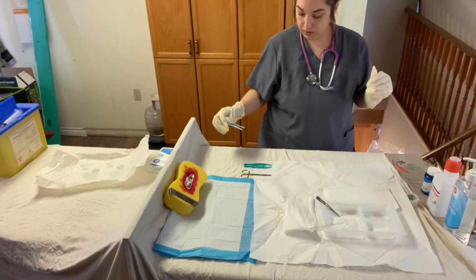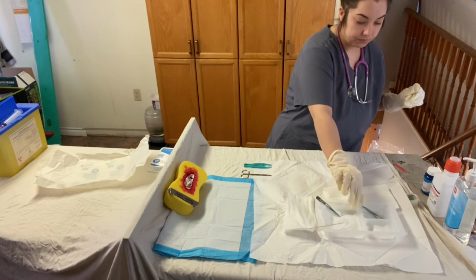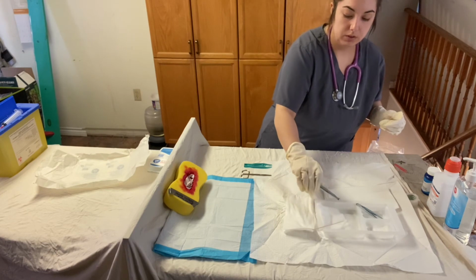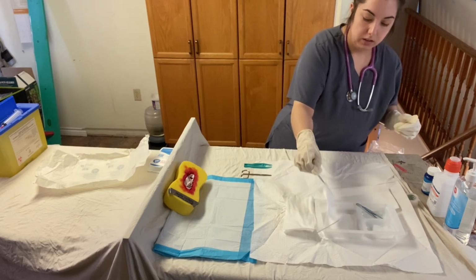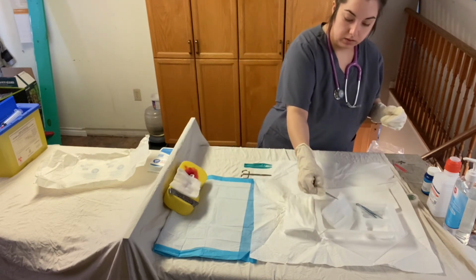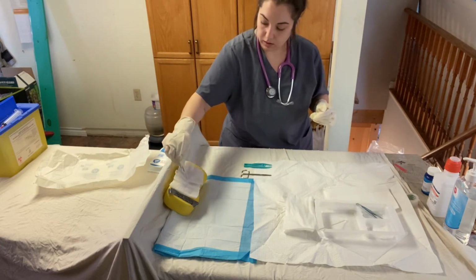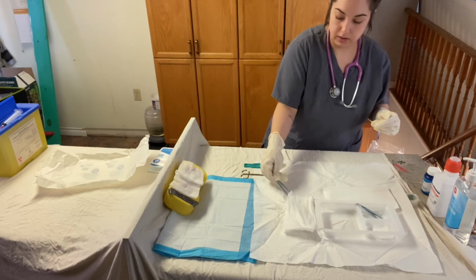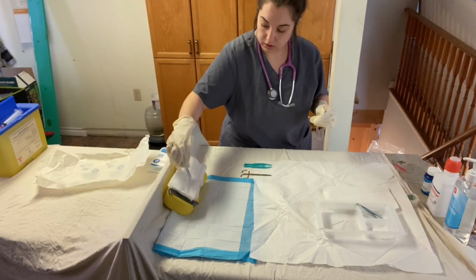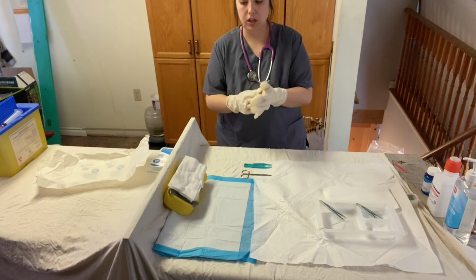Perfect. So next what we're going to do is we're going to place some 4x4 dressings on the wound. So I'm just going to use my tweezers, assessing the wound. Looks good, it's healing properly. Perfect. So the wound is covered there, and then I'm going to add that abdominal 4x4 because I did see a little extra drainage there in the beginning. So just to be safe. Perfect. Now sterility doesn't matter as much because the wound is covered.